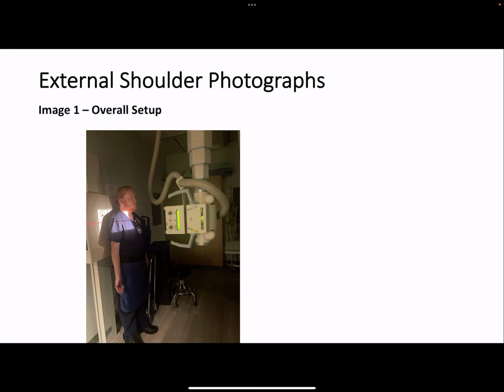The patient is standing erect, positioned in front of the wall bucky, with his posterior side facing the wall bucky. And we put a slight rotation toward the side of interest to place the shoulder in contact with the wall bucky.